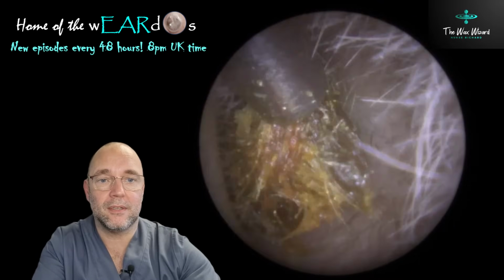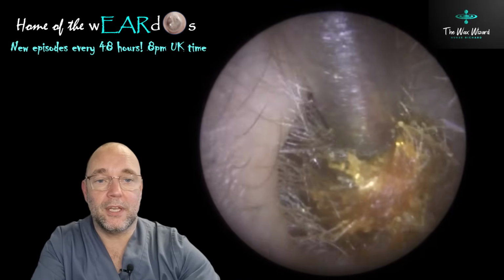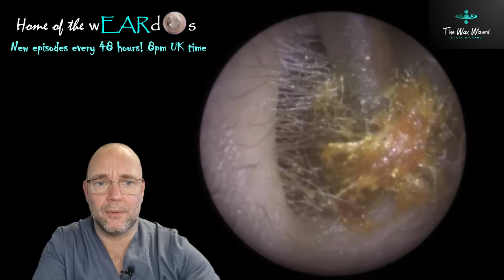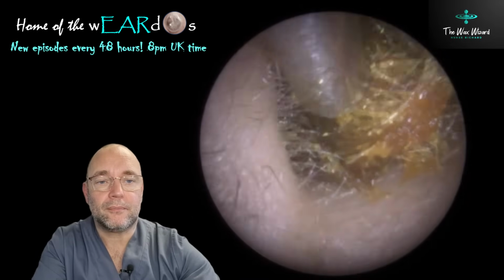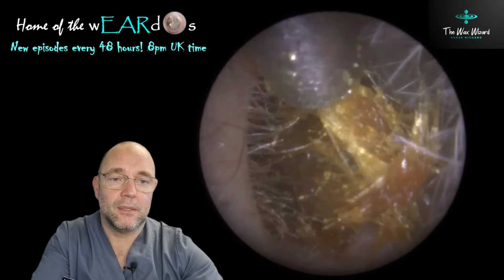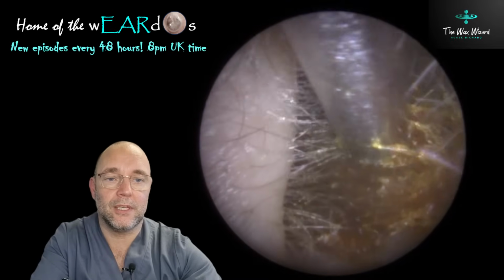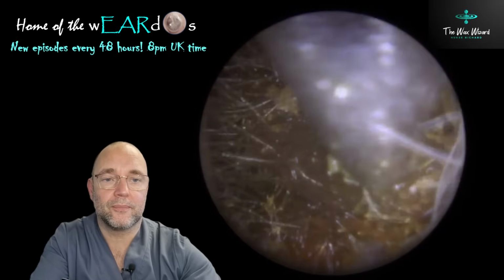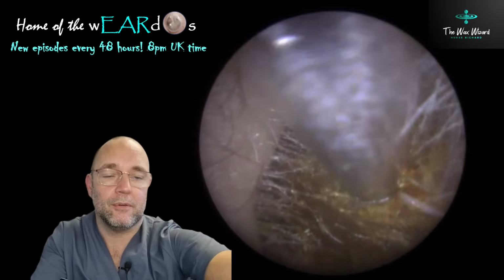So it's obviously hairs that are probably just shedding, falling off. I don't know if there's anything being poked around inside there. Possibly. I don't think so, because it was quite lateral, this wax. It was quite near the outside. It wasn't particularly deep down, so I don't think they've been shoving anything in there. But still, it was an extraordinarily large amount of hairs in all of these ones, and that's kind of why it's difficult to get a grip on these things, despite having the suction on full power. It made it really difficult.